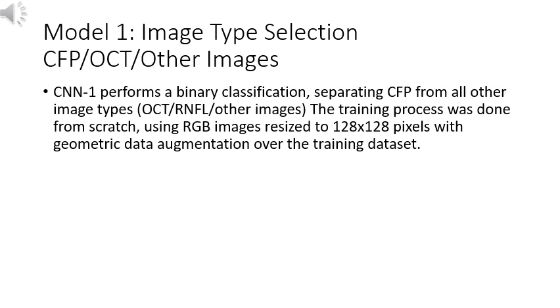over the training dataset. It should be noted that the CNN1 has only 3 convolution layers, 3 max pooling layers, and 3 dense layers. As a result, the CNN1 has fewer parameters than very deep models, such as Inception, VGG19, and ResNet 50, among others. Its shallow architecture makes it computationally inexpensive, which is beneficial for increasing the processing throughput of our CADX pipeline.